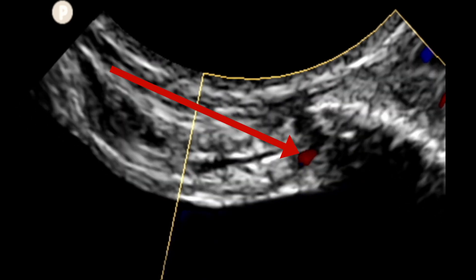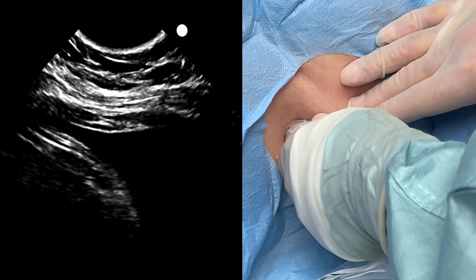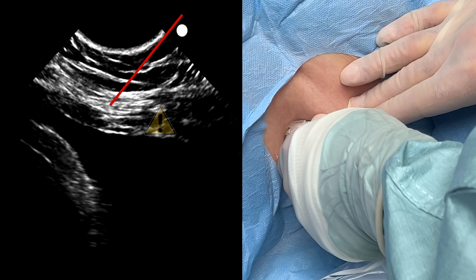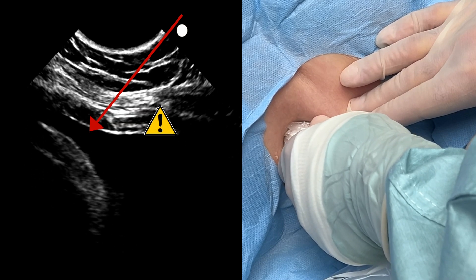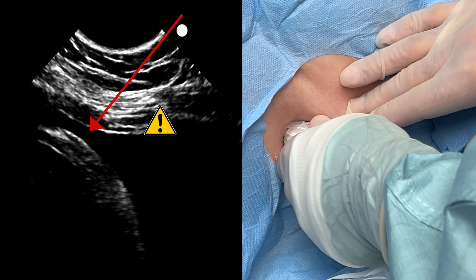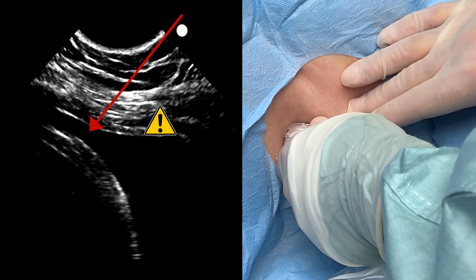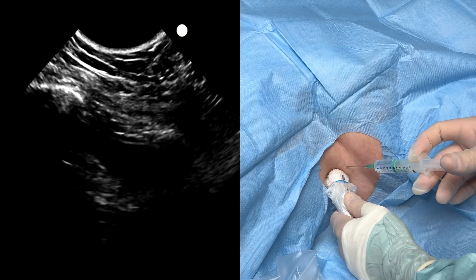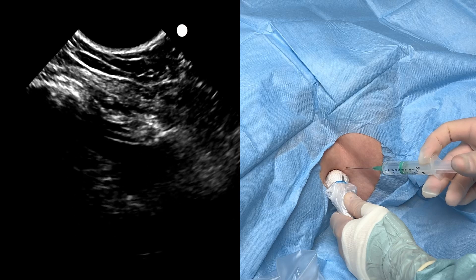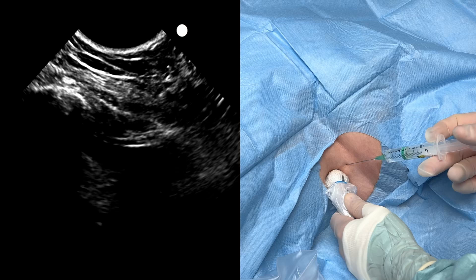Here's an example from another patient. Cannulation requires excellent in-plane technique. Choose a clean path between the ribs and avoid the no-go zone where you expect the neurovascular bundle. There is absolutely no need to have a halfway stop on the lower rib, as would be the case in the blind approach. Anesthetize with a long-acting local. Aim to reach the pleural line without puncturing it. Five milliliters will flood the intercostal space and reach the nerve.